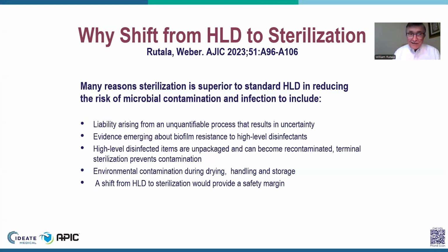We have the fact that high-level disinfected items are unpackaged and can become recontaminated, whereas, of course, the terminal sterilization process prevents that recontamination. And then, of course, we have environmental contamination during drying, handling, and storage. And of course, lastly, all that's going to be resolved by a shift from high-level disinfection to sterilization, which will provide a margin of safety.